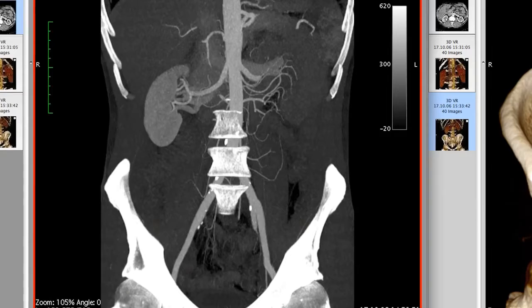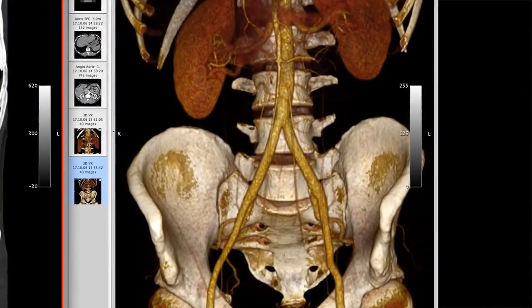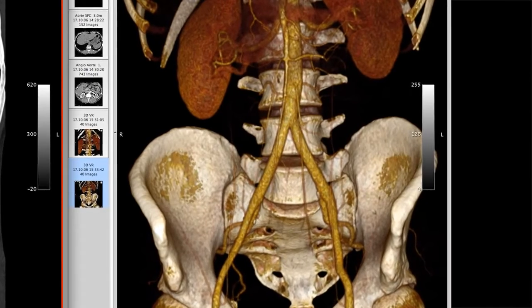That's a 2D plan. Ultimately, in the 1990s, more or less, people started to play with things a little more sophisticated and said, well, what if we had several fields from different angles, right? And what if now we shaped these beams so they were in the shape of the tumor we're trying to hit? Sort of like a beam's eye view, right? From different angles. That's 3D. And the question is, in 3D planning, what are my optimal positions for my beams? Because I might be talking about 2, 3, 7, or 8 beams, but not a lot more. And I've got to find optimal positions for them and optimal shapes.